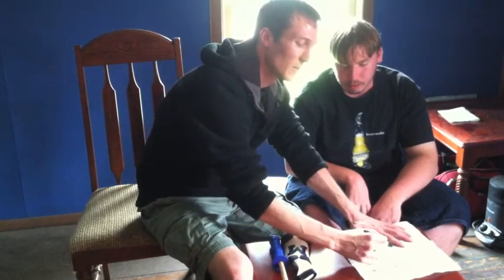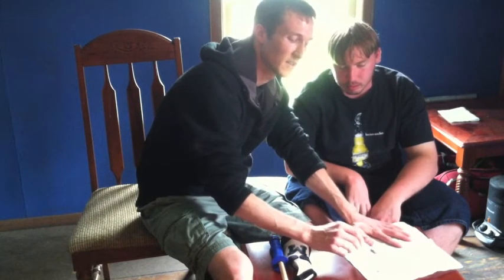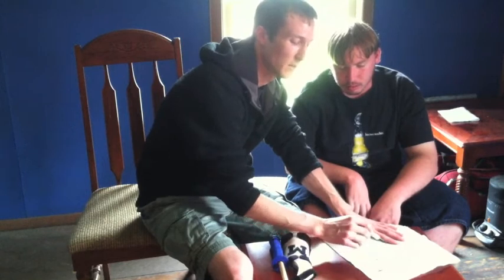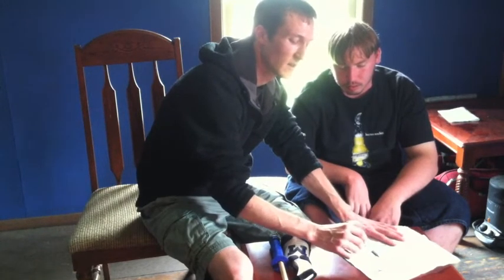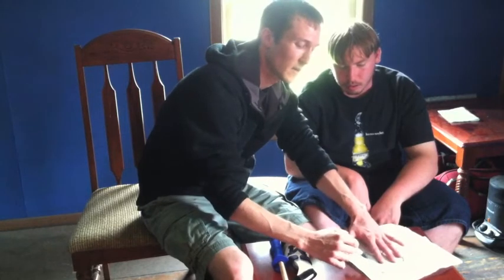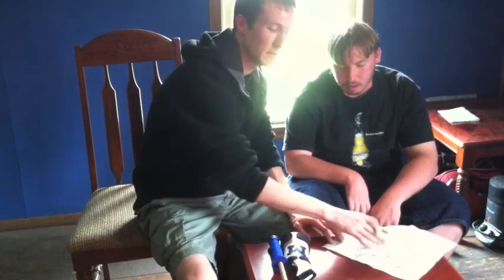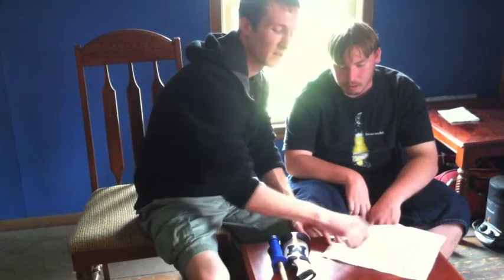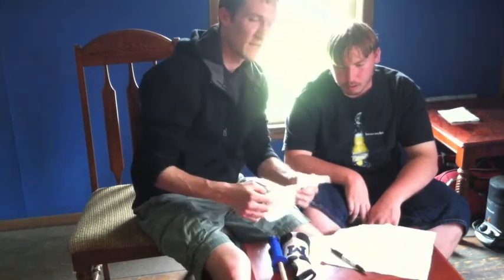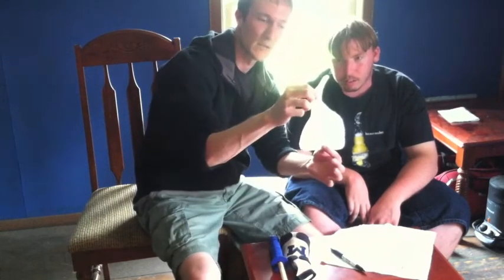And then when I'm bringing this around, I'm going to keep that intersection point in mind. I'm going to trace this around here and go just inside that intersection point, and then come back around here and then around here. So obviously this is much bigger right here, but I'm going to cut this pattern out. After a couple of tries and some modifications too, this is about the size that we got right here.